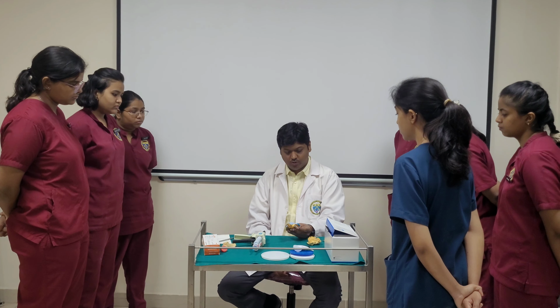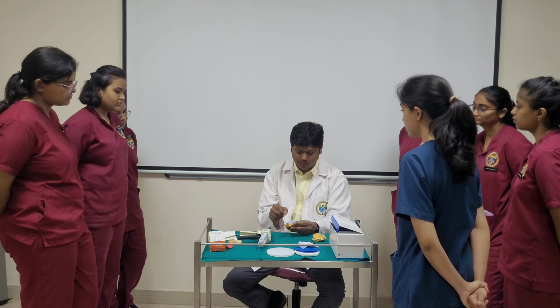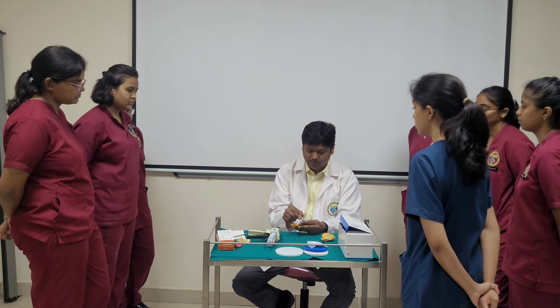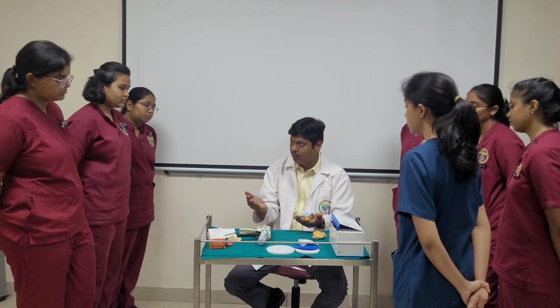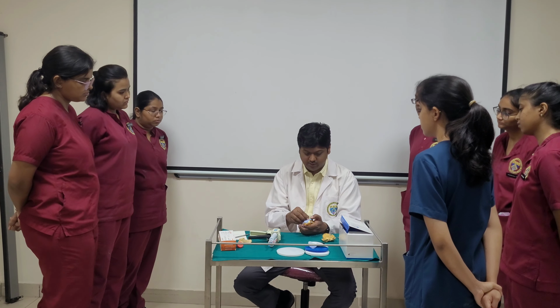So again, as I told you, the disadvantage of closed tray is that there is a chance of human error incorporation when you are trying to take it out of the patient's mouth and placing it back inside the impression. Whereas your open tray will come out like a pickup impression with the impression itself.